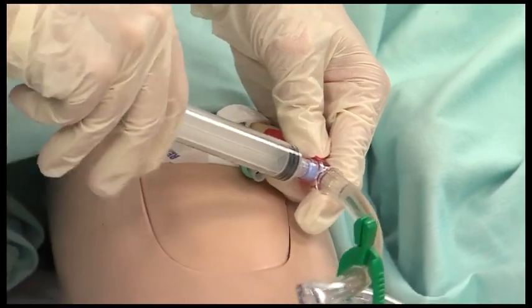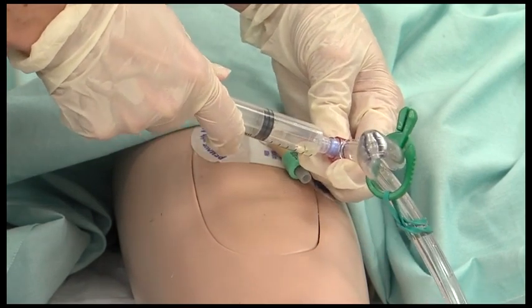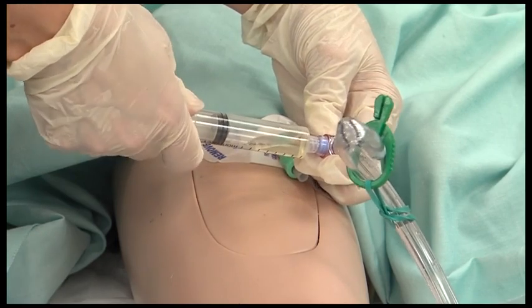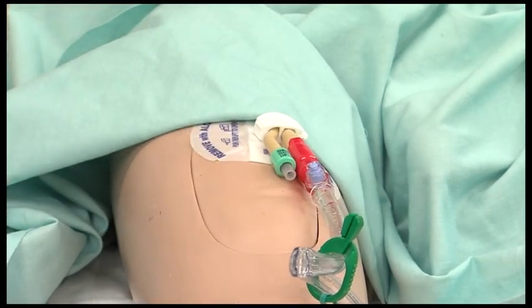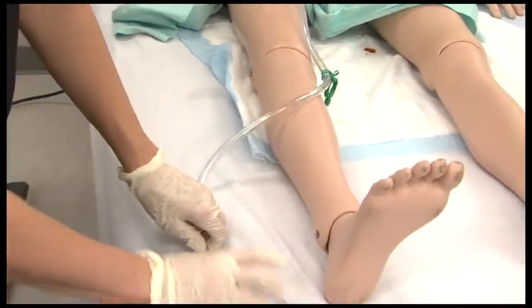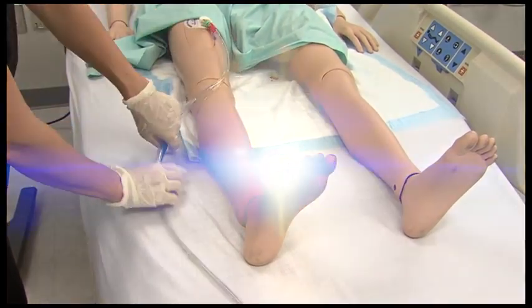The port may also be accessed using a slip-tip syringe. Aspirate the desired volume. If using a syringe, transfer the specimen into a specimen container, label it, and place it in a transport pouch. Send the specimen to the laboratory immediately or refrigerate until transported, following hospital instructions. If using a specimen tube, label the tube and place it in a transport pouch. Follow the hospital specimen handling guidelines.